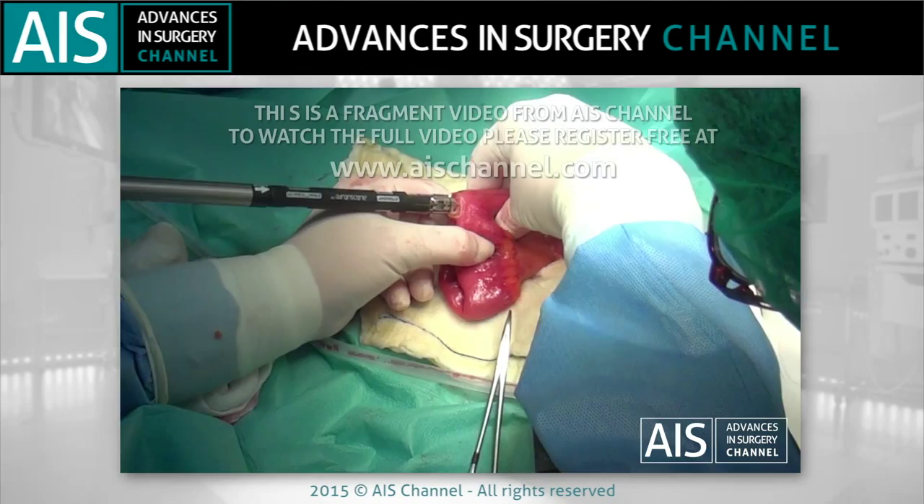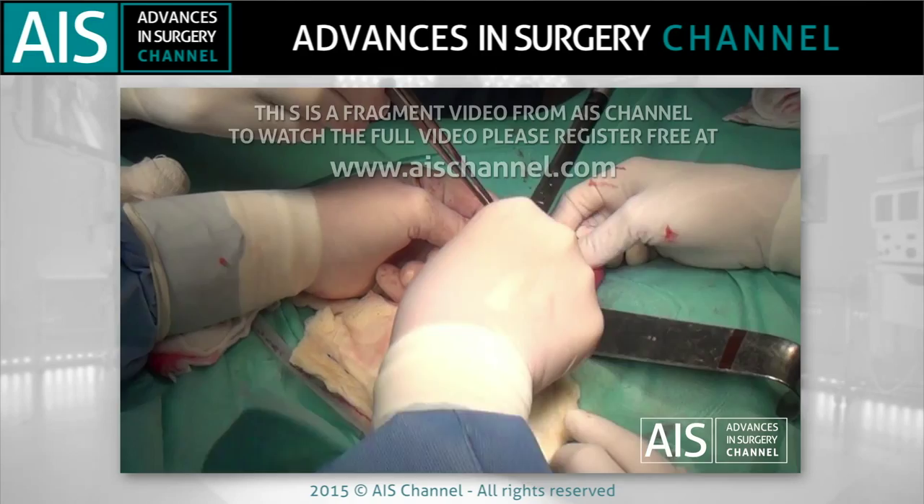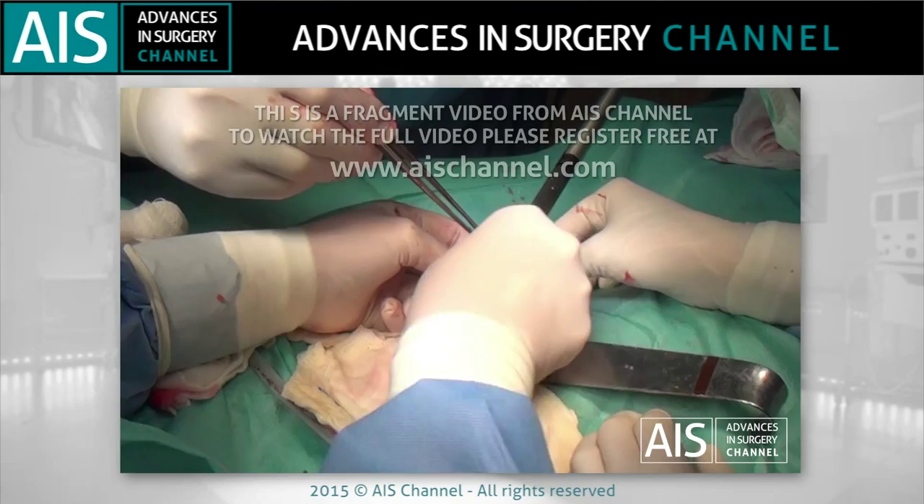Several firings are made toward the proximal part of the pouch. The mechanical suture creates a common cavity inside of it. One firing is made toward the distal part.